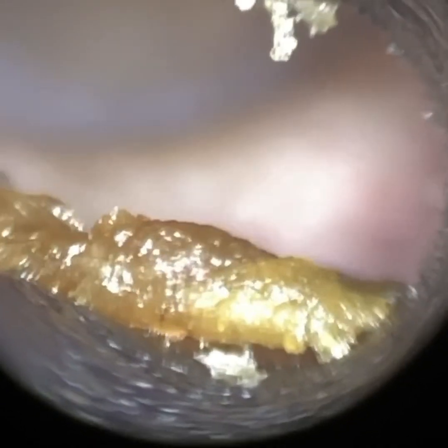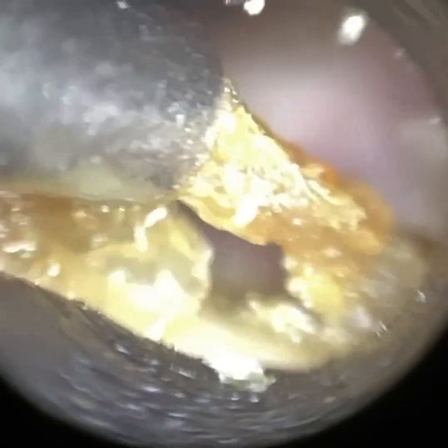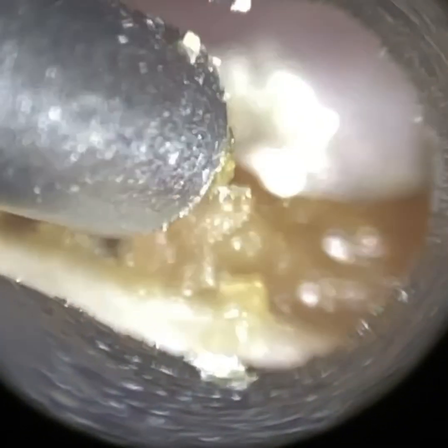I had a patient who has bilateral hearing aids and they had some occluding keratin, quite lateral, and it was causing the hearing aids to feedback, to whistle. So he's come in and we're just removing this sticky, more lateral dead skin off the canal wall.